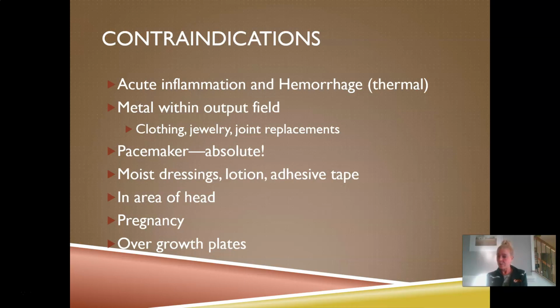Pacemakers are absolute contraindications. Moist dressing, lotion, adhesive tape, again, because there is some moisture created with the application of diathermy. This would be more of a precaution, really. We never want diathermy over the area of the head. Again, we're talking like fluid-filled cavities. Pregnancy, again, makes this list, as it will most.